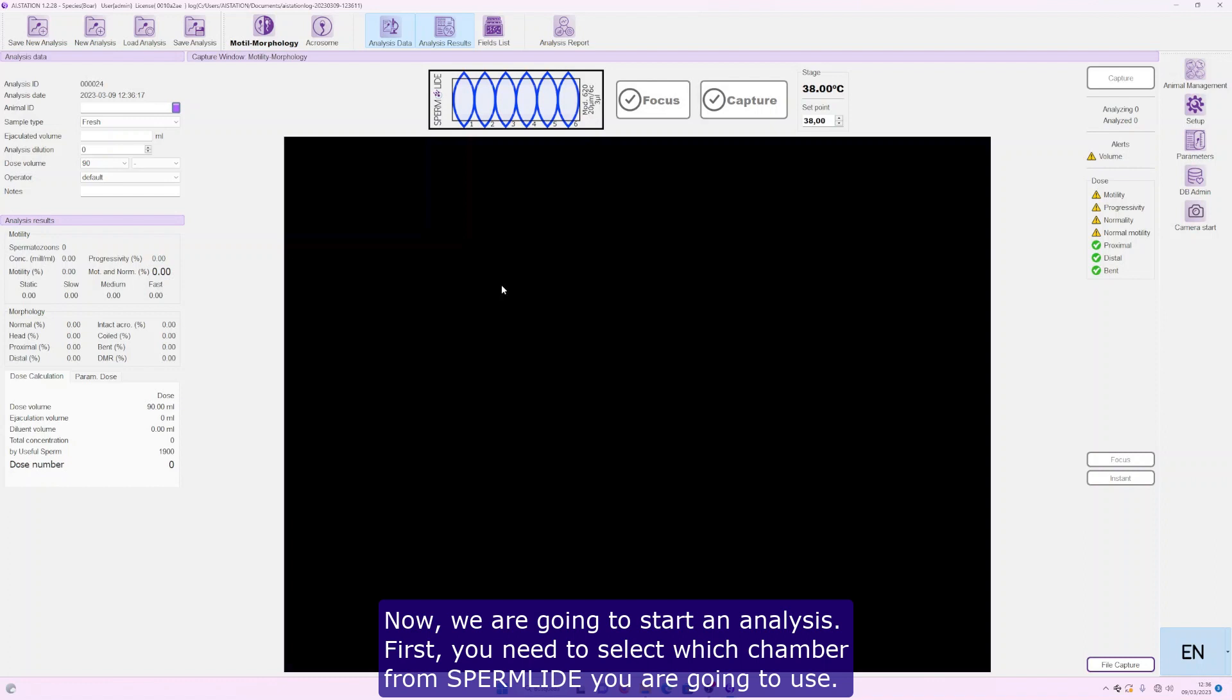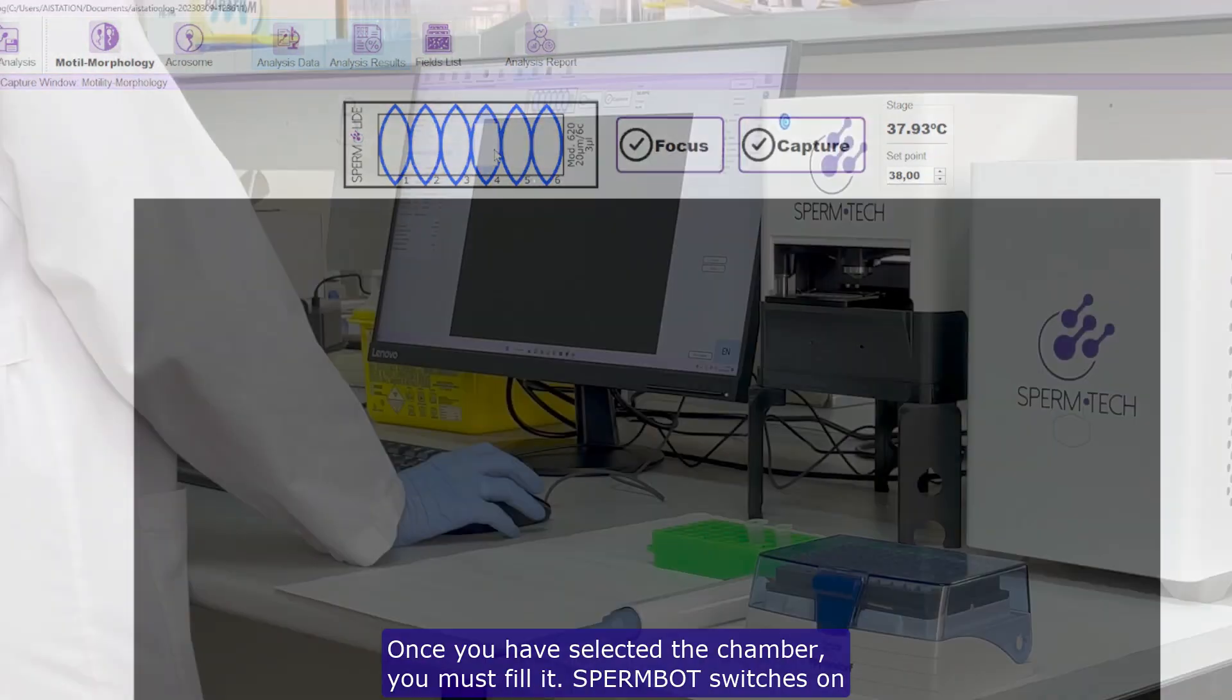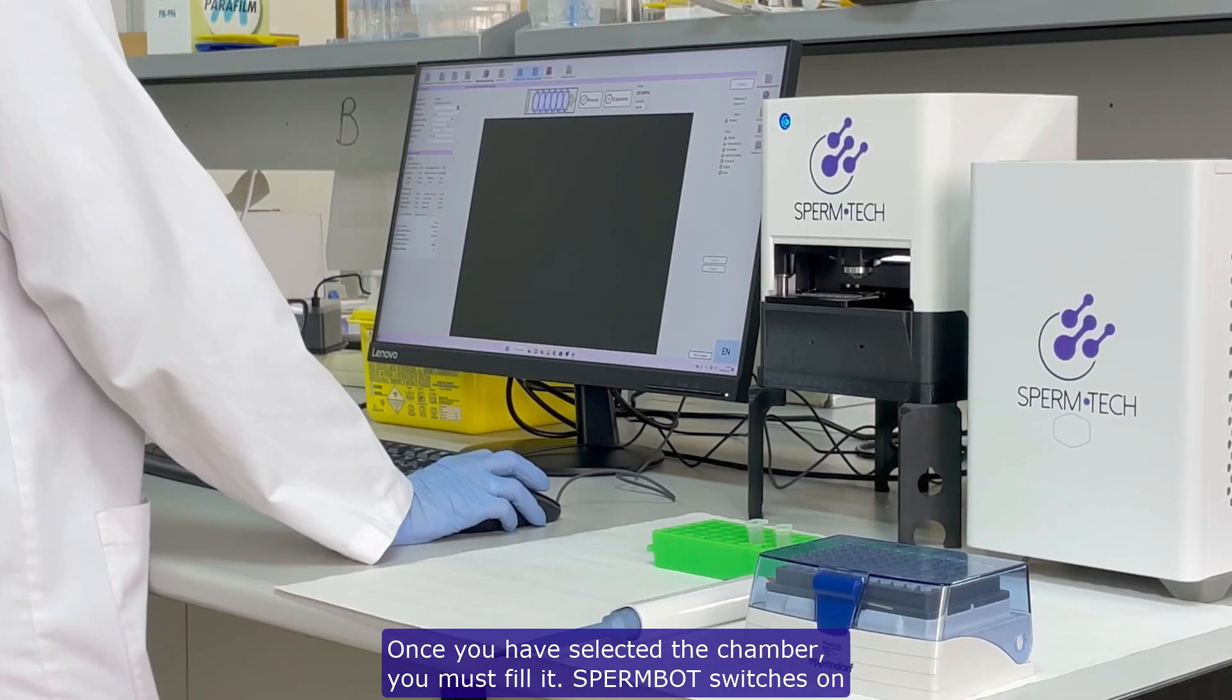First, you need to select which chamber from SpermLide you are going to use. Once you have selected the chamber, you must fill it.